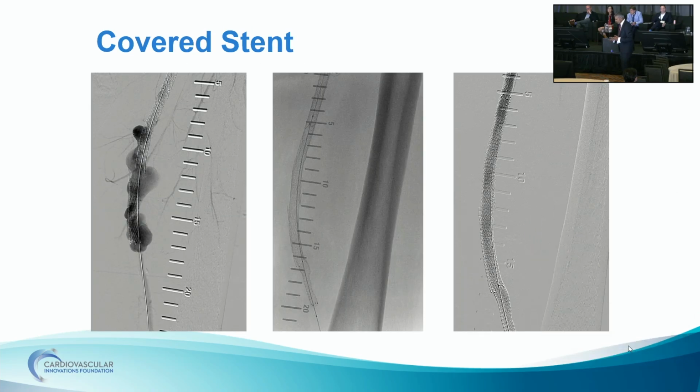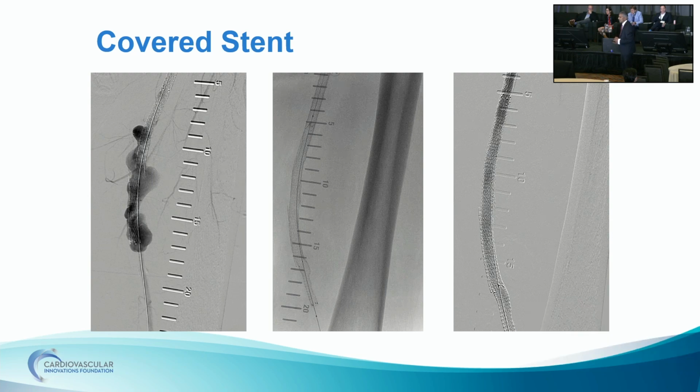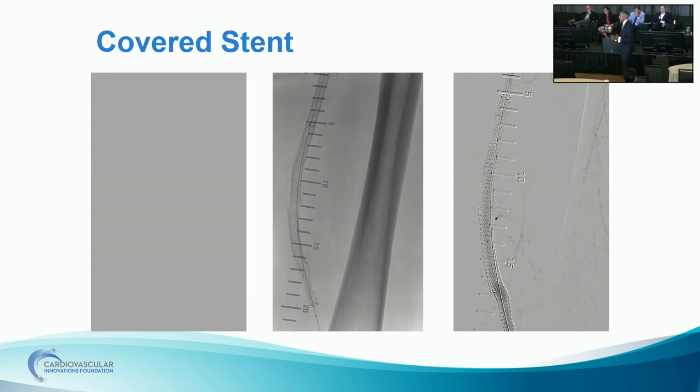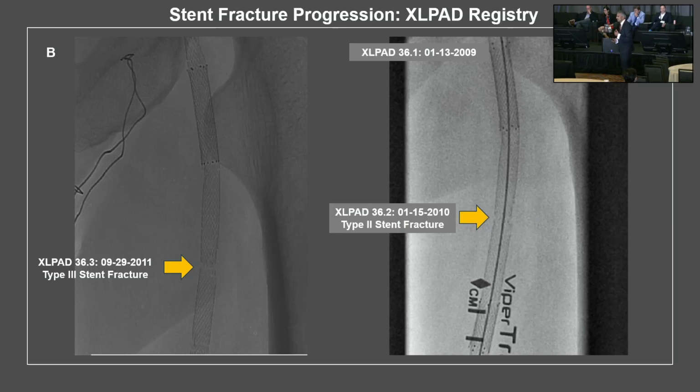The crossing of the stent was a little challenging, but ultimately we were able to cross it. After balloon angioplasty, we were able to put a covered 7mm Viabahn. I was trying to put a little smaller. I remember Chris pointing out to IVUS it again and put a little larger, and I think that was the appropriate call. We achieved good success, and the patient has done really well. But this is the case that actually has led to a deep dive into the registry's angiograms.